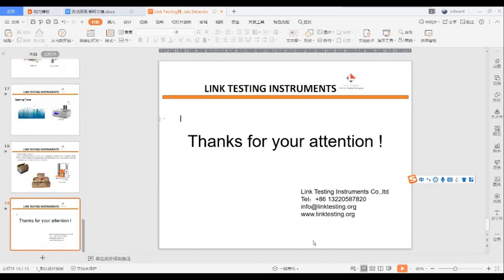Okay. That's all. This is a very simple introduction. If you have any questions about them, you can ask me. Maybe in the near future, I will send you some standards for the instruments. You can read the standards, and you will know how to test it and why you test it more clearly.